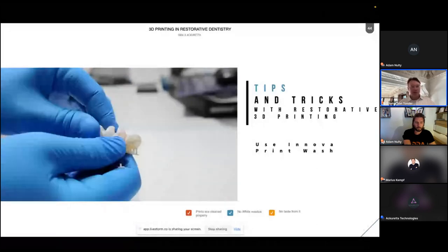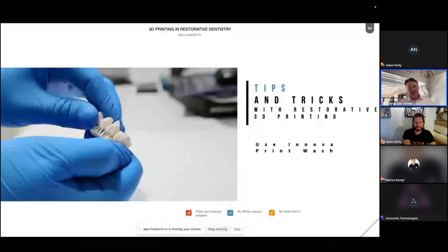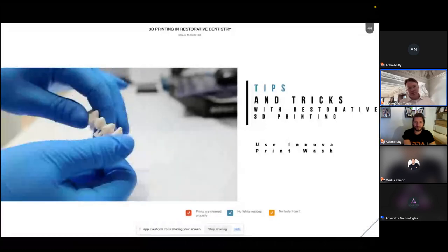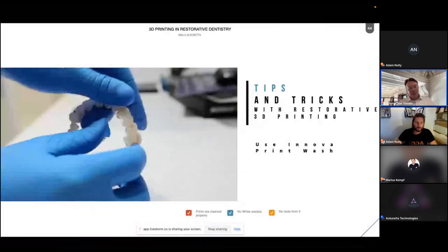And then also, if you look closely, and Julia and Marius look away, that is a 12-unit bridge that I've printed for a patient. And that's not an indication for this material. But we're pushing the boundaries a little bit.